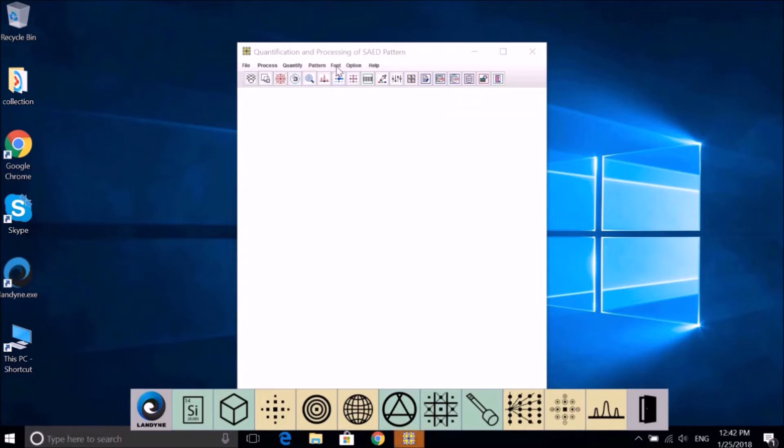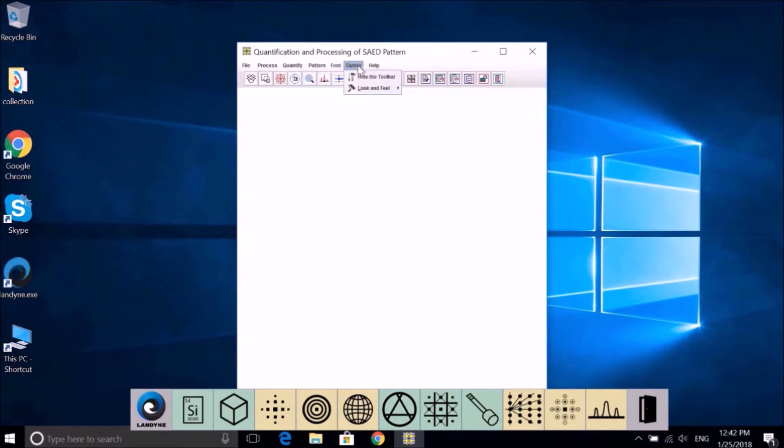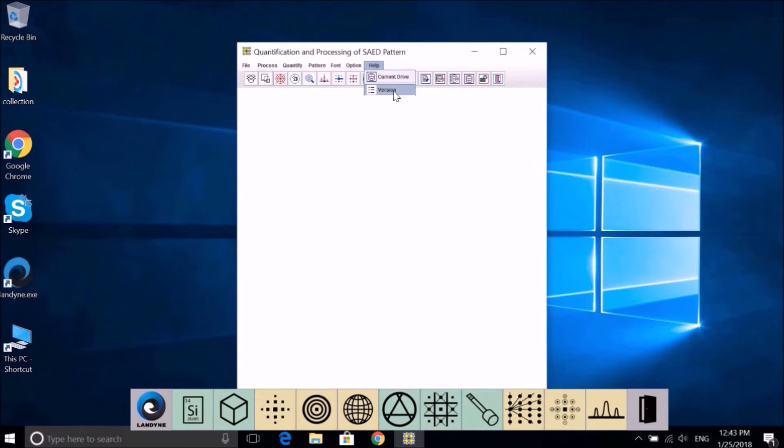The font will control the size and also the color of indices and the style. There are three styles to choose. Help includes current drive, serial number of your hard drive, and version.